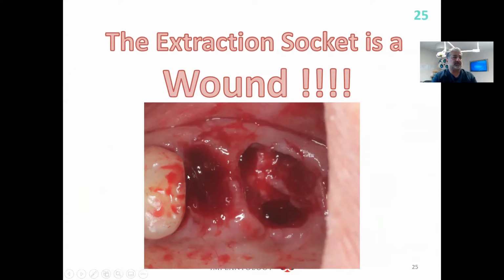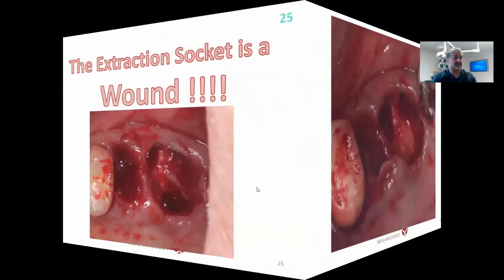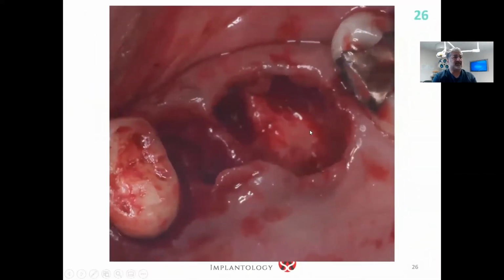If you've got these two teeth taken out and all this mess is in there, this chronic inflammatory tissue is in there, don't leave it there. There's bacteria in there. It all needs to be cleaned out, and fresh blood needs to be coming into that area to reduce the chance of septic sockets. That's better now. So we've cleaned everything out. We've taken all the granulation tissue away. There's going to be a better chance for good healing in that area.